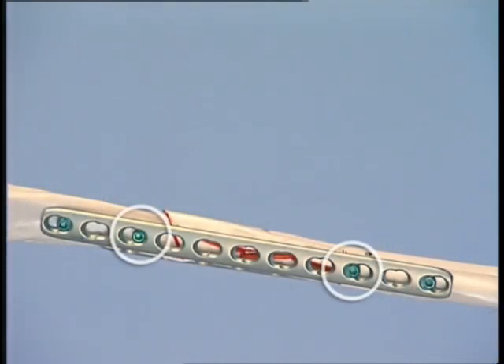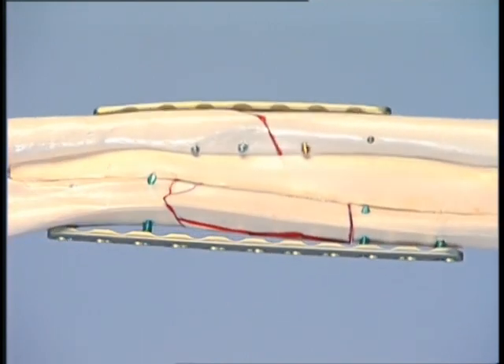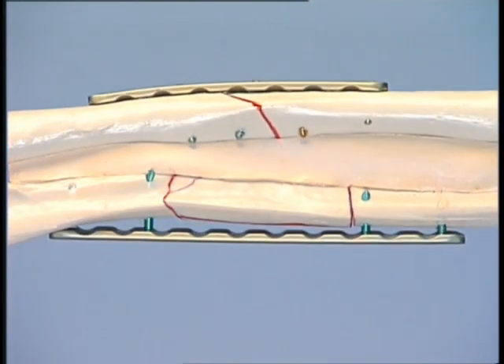Two more bicortical locking head screws are inserted close to the fracture area in the same manner. With two screws in each fragment, leaving one hole empty between the two, adequate stability to bridge the complex fracture is obtained. This exercise has illustrated how the LCP can be applied in two different ways: first as a conventional compression plate for the simple fracture of the radius, and then as a purely internal fixator to bridge the complex fracture of the ulna.